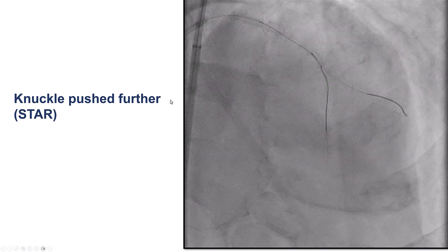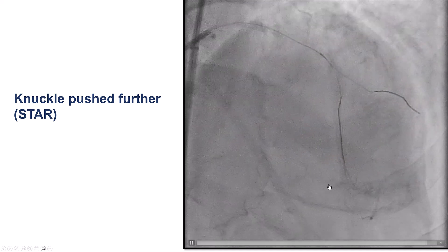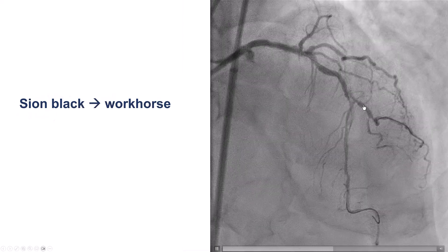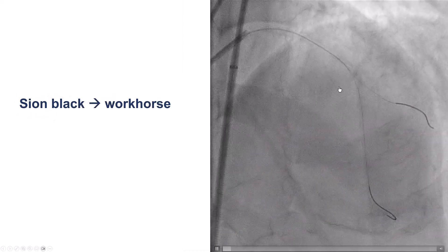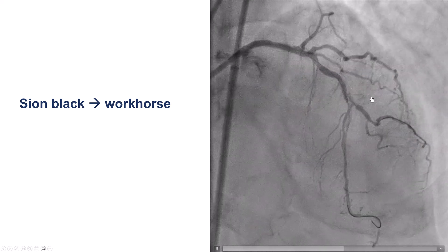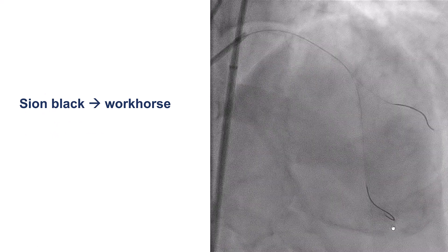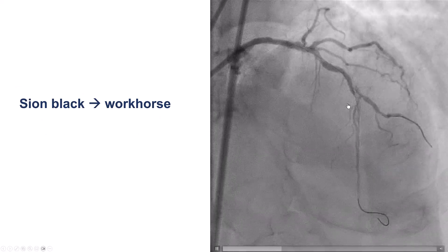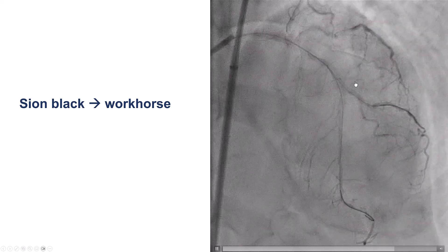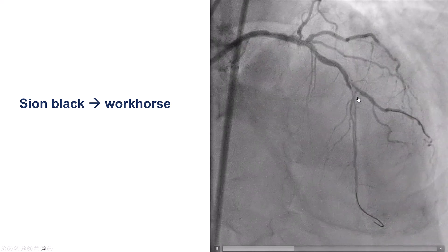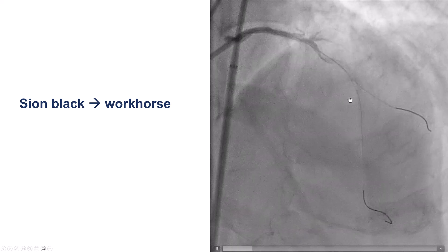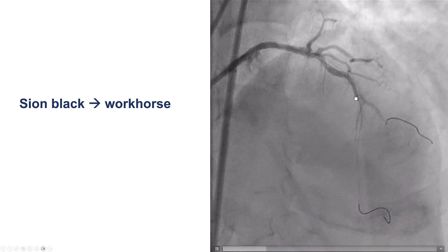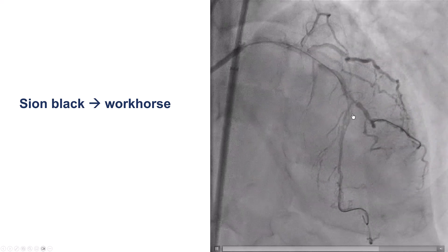We ended up advancing it, and this essentially is more of a STAR technique. We then switched the Confianza Pro Black wire that was intended for the reverse wire technique for a workhorse guide wire in the LAD. The LAD looks very hazy, so there is likely an area of dissection — we may have propagated it, or it may have been there from before. The area of the middle LAD where the diagonal comes off seems to be hazy and dissected.